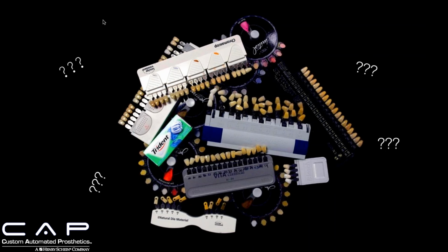My favorite is actually, I don't have a cursor here, so I can't scroll over it, but the darker shade guide to the top right-hand corner is an old Pearl Effect Ivoclar shade guide, and they've discontinued this older model. I actually found a brand new one on eBay. I paid like $30 for it, which isn't too bad, but this one that I have here was kind of beat up, and I wanted something a little bit newer to add to my repertoire here. But that's got some beautiful Pearl Effect opalescence, and it's a really nice shade guide.